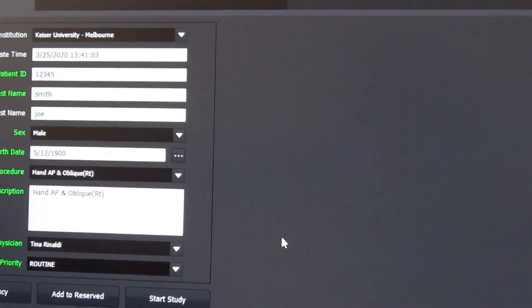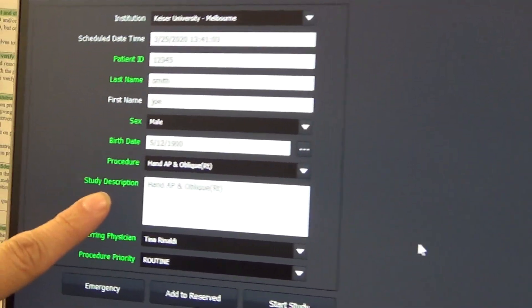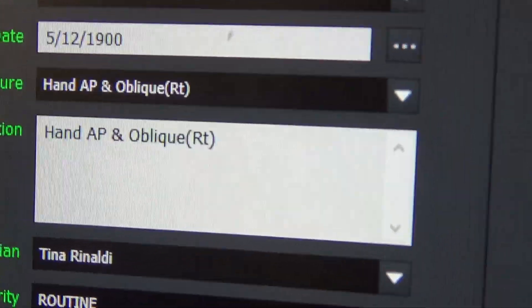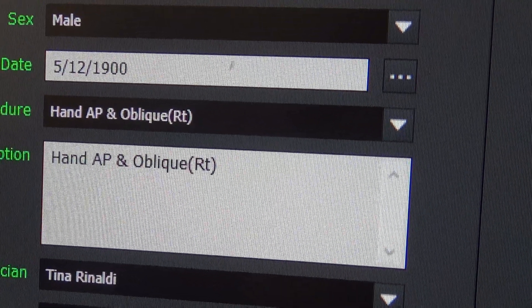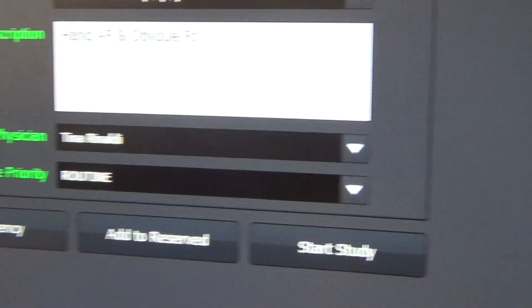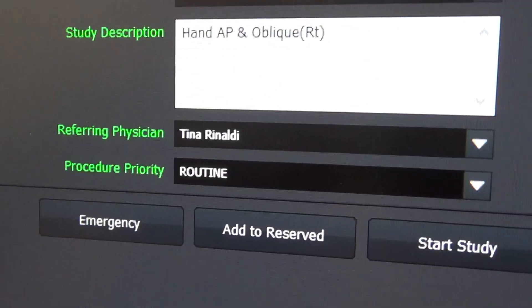It's important that you pick the body part that you're x-raying because this prompts the machine to set the automatic exposures for you. Hand AP and oblique, and it's the right hand. And then who the referring physician is and what type of actual procedure priority it is — so routine. So then we're going to hit start study. Very simple.